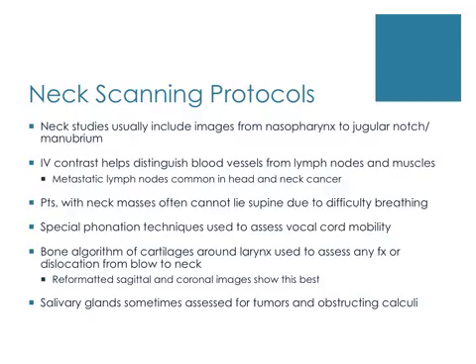It used to be that the transverse plane was the preferred plane for interpretation of the neck and blood vessels, but now multiplanar reconstructions in coronal, sagittal, and oblique planes greatly enhance the radiologist's ability to diagnose. So to avoid artifacts on soft tissue algorithms caused by dental artifacts and capped teeth, the technologist should tilt the gantry to avoid these artifacts if possible.